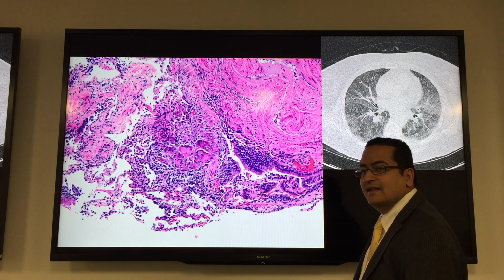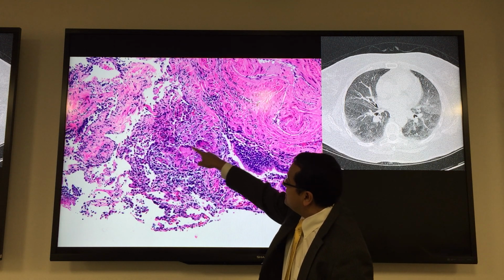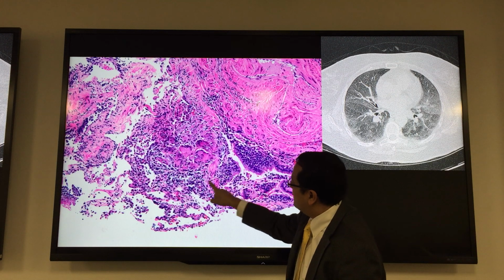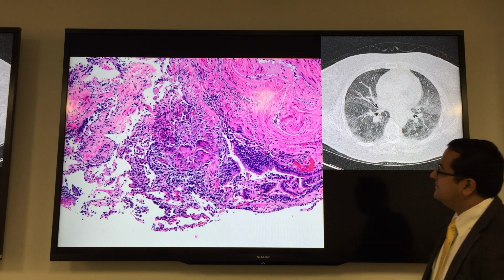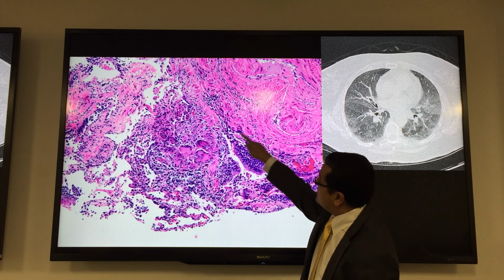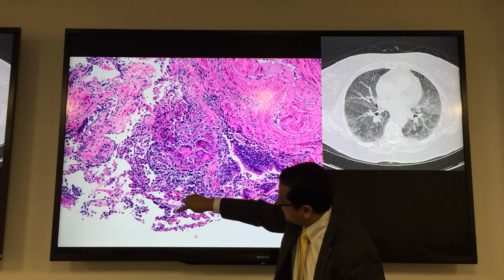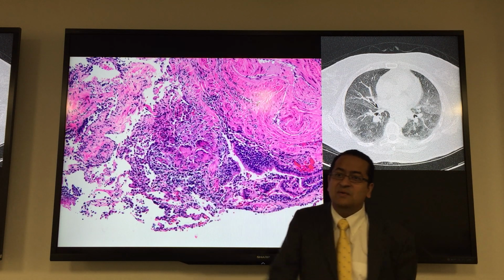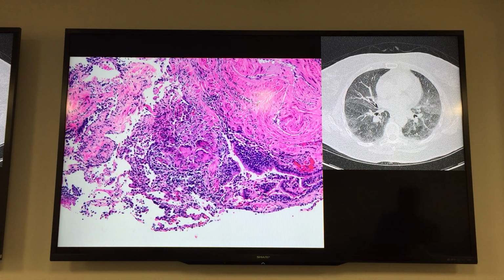Third years? Yes, that's correct. Like here, right, Maria? Giant cell. And then what's in the background here? Lymphocytes. So it's not just in the bronchiolar mucosa, which is there, but it's also going into the interstitium here with a few giant cells. Anyone? What is this? HP. What does that mean? Hypersensitivity pneumonitis. So that's a big diagnosis to make, right? Just based on a small biopsy. But that's another thing you can diagnose.